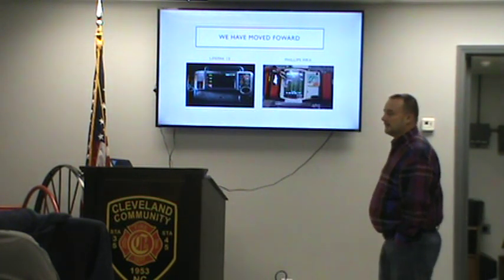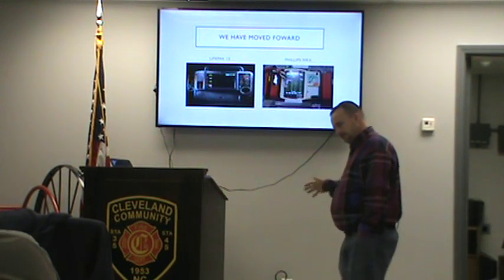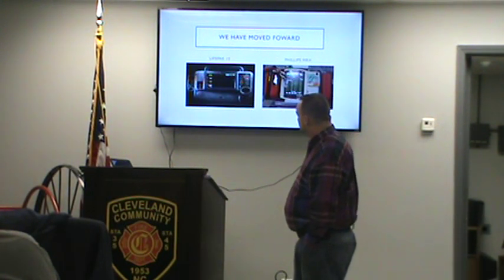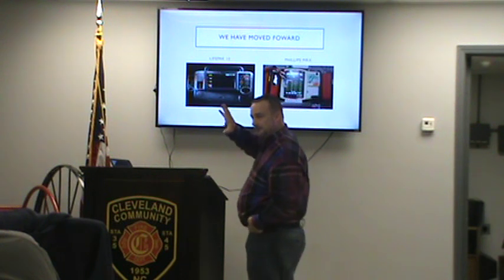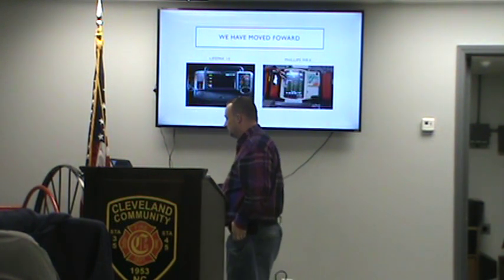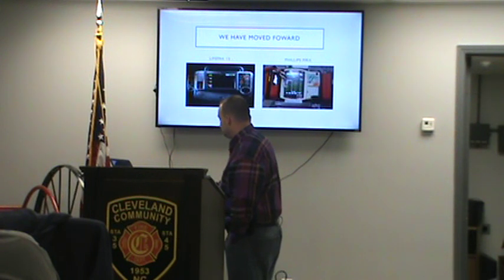The only thing is, a lot of times your cords and stuff jingle a little bit, and that can give you problems with artifacts. That means instead of getting a pretty 12-lead, you're getting that in the middle of it. So that's what we've come to about now.